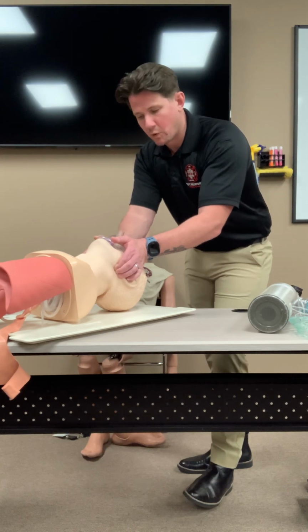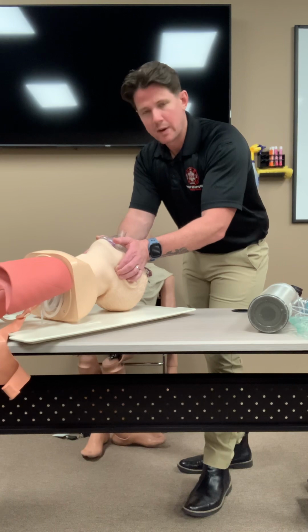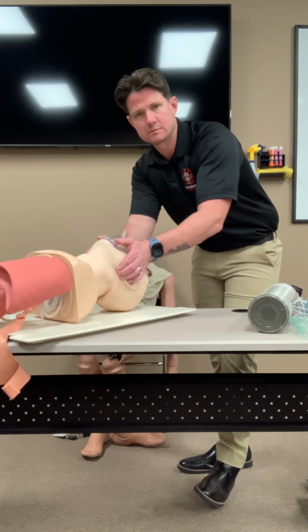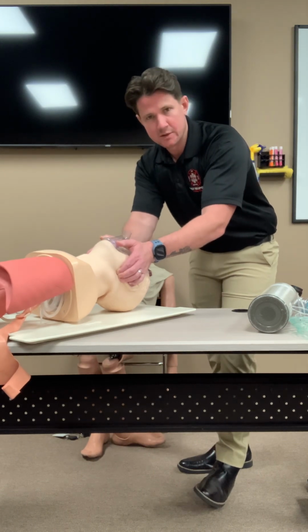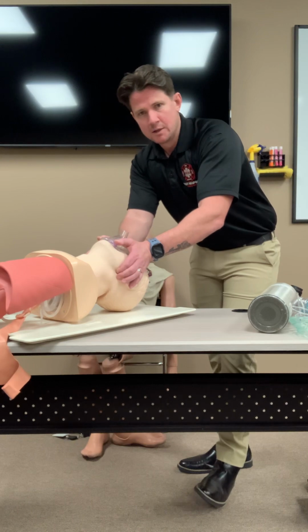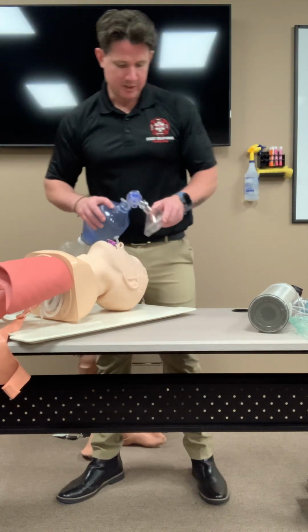So that's one of the 2 techniques. Either way, you just need to walk your second rescuer through how you want them to hold the mask and how you want them to assist you with 2-person bagging, okay? If you are going to do the mask, then you just verbalize how you would do it, one of the couple ways I just showed you. Cool. That's pretty much it for that.